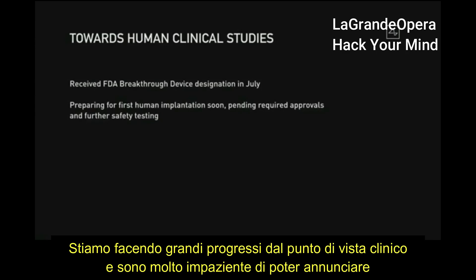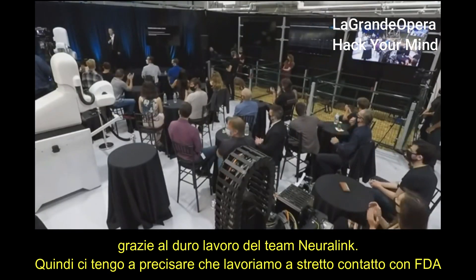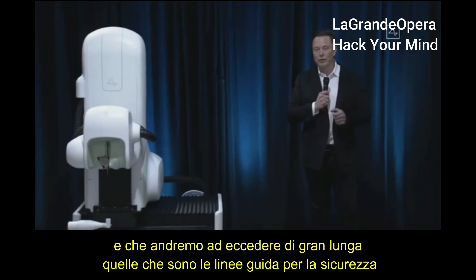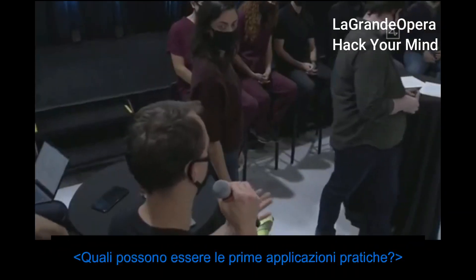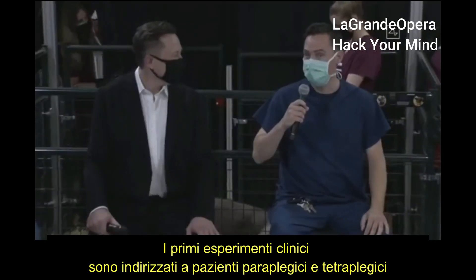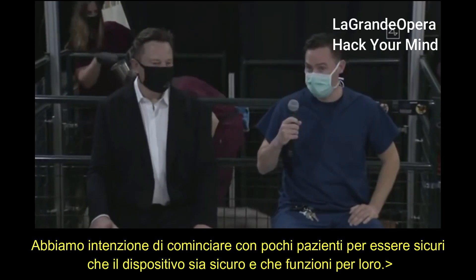We're making good progress towards clinical studies. We received a breakthrough device designation from the FDA in July, thanks to the hard work of the Neuralink team. We're working closely with the FDA and will significantly exceed the minimum FDA guidelines for safety — we will make this as safe as possible. Our first clinical trial is aimed at people with paraplegia or tetraplegia due to cervical spinal cord injury. We're planning to enroll a small number of patients to make sure the device is safe and works.